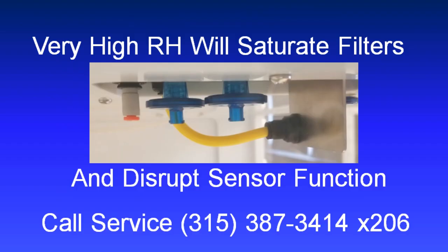And again, if you do end up saturating a sensor, it's not the end of the world. Just give us a shout and we'll walk you through drying that out.